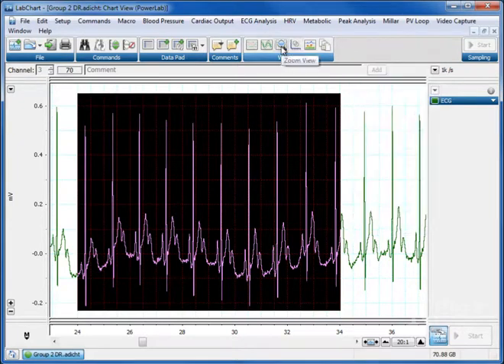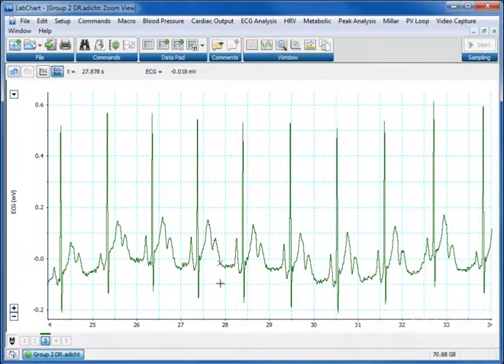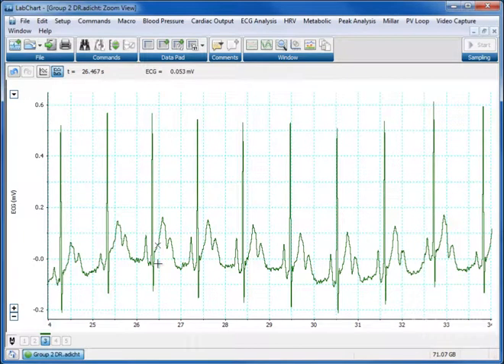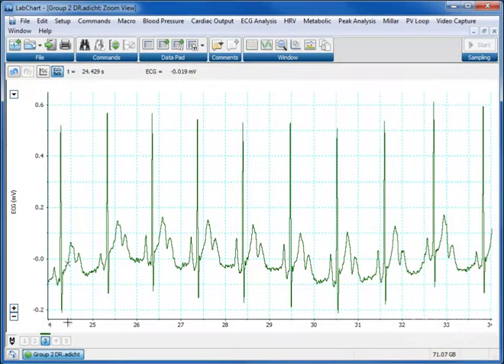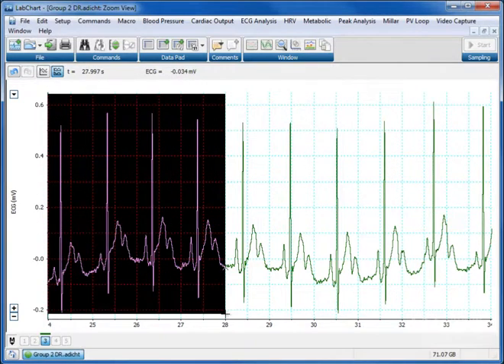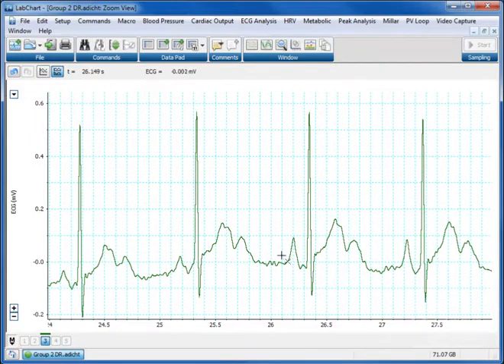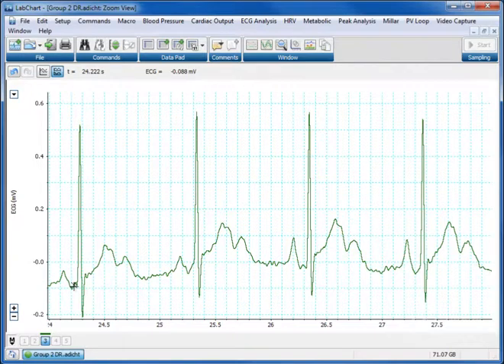So you can click on the zoom window here and now it's loaded these ECGs into what's called the zoom window. You can interrogate them further so we've got from 24 to 34. Let's only look from 24 through to 28 and now we've zoomed in even more and you can see we've got a much higher fidelity picture here and it's much easier to do analysis.